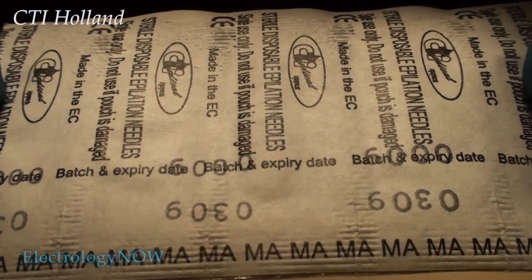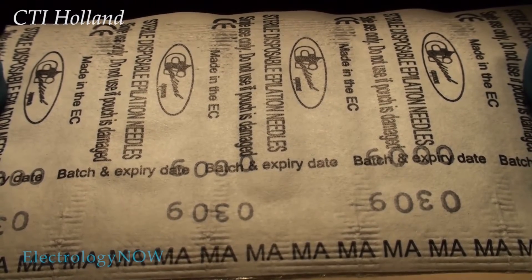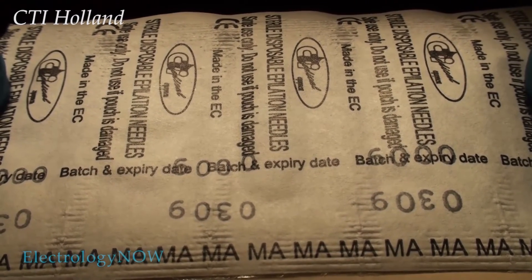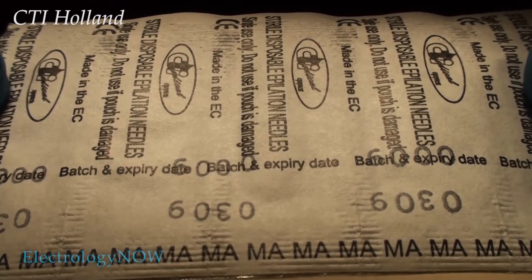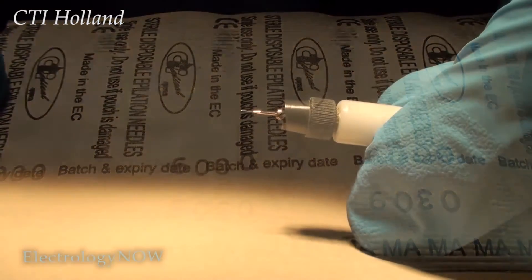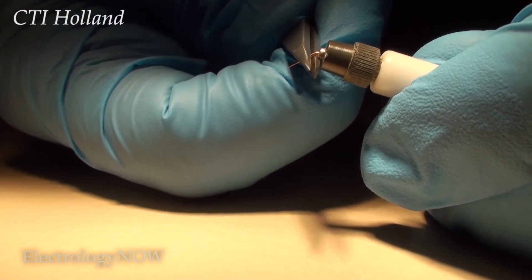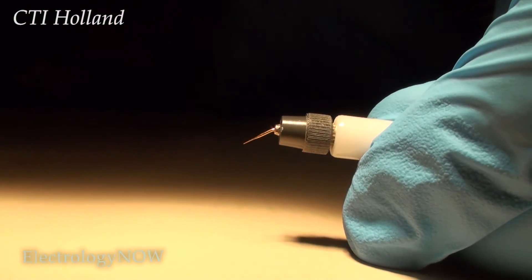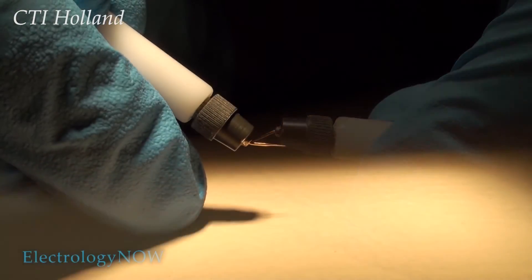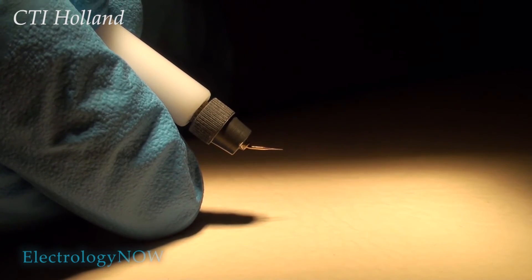In the no longer available category, these are needles that were made by a Dutch company called C-T-I. These were nice needles. They bent easily and they were gold-plated. This is a small size for tiny hairs. This is your C-T-I gold-plated needle.